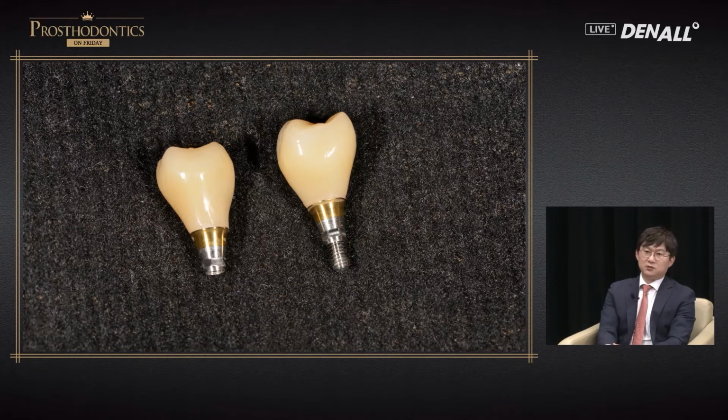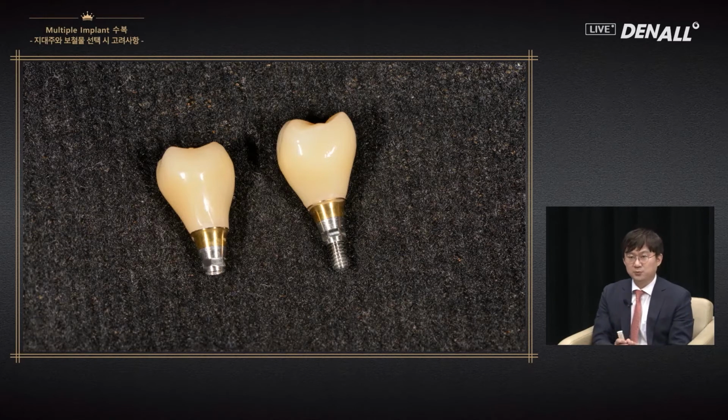In using this, we need to select the abutment there, stock abutments, or sometimes titanium link is used. When we use a stock abutment, we choose them based on the cervical diameter. 6 to 7 millimeter diameter abutments are used for the molar, and 4 to 5 for premolars according to some criteria.